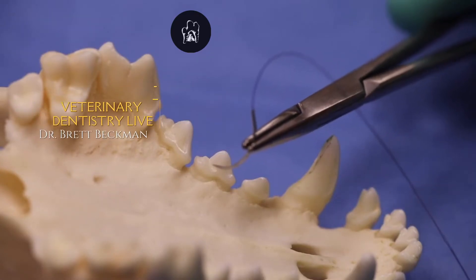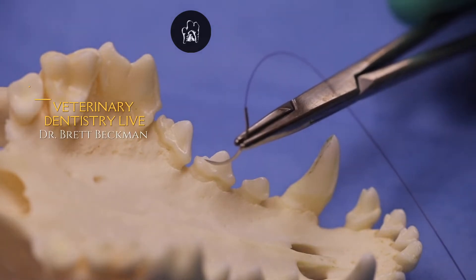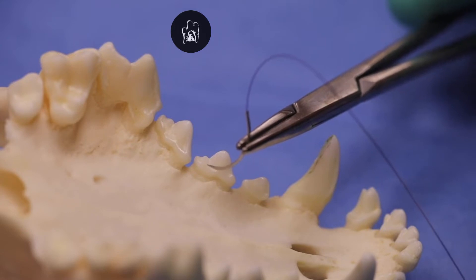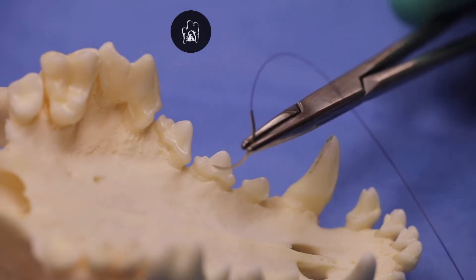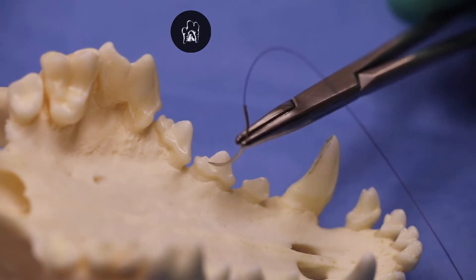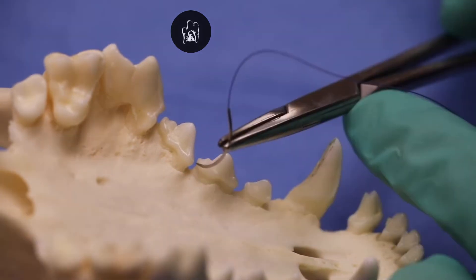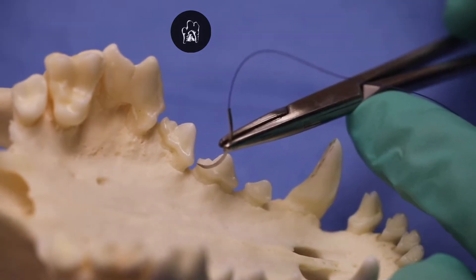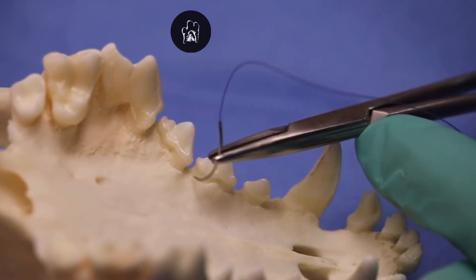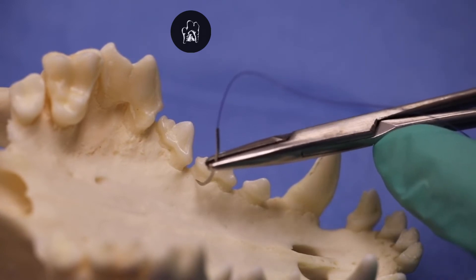One of the big questions we commonly get in labs is how do we get a suture through the interdental space to start our closure when we do a mucoperiosteal flap? This commonly comes up in maxillary canine and mandibular canine extraction where we do a sulcular incision back to the third premolar. So even if these two crowns are touching, there's going to be a space between the crowns that are under the marginal gingiva.